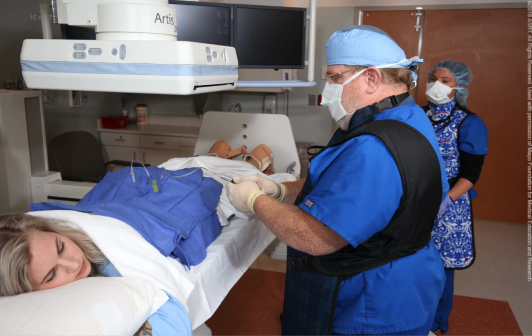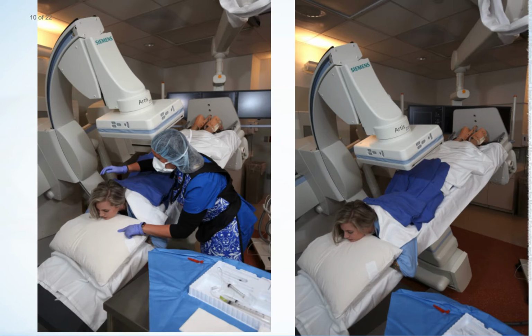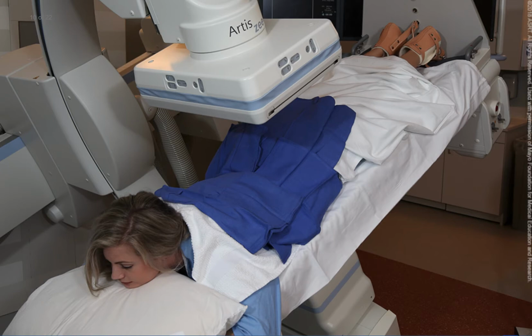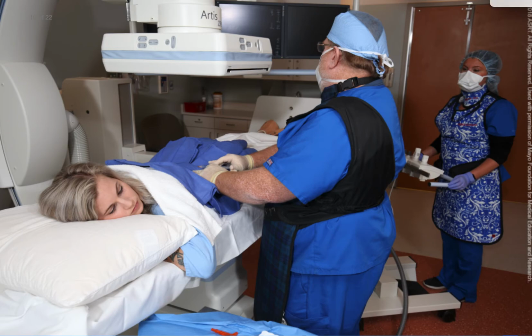After injecting contrast, begin a cervical myelogram by hyperextending the patient's head and placing their chin on a chin rest to create a trough in the lordotic curve. This position also helps prevent rapid ascension of the contrast into the basal cisterns. Ensure patient support devices are properly engaged. Then slowly tilt the table into a Trendelenburg position while observing the column of contrast moving into the cervical area. Once contrast reaches the proper area, return the table to a horizontal position.